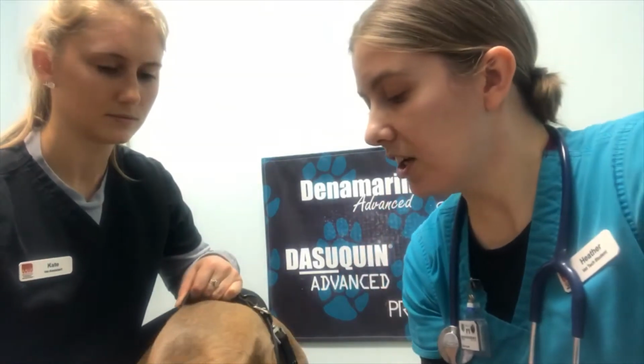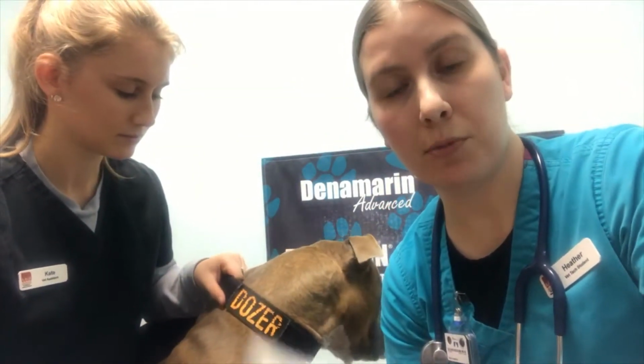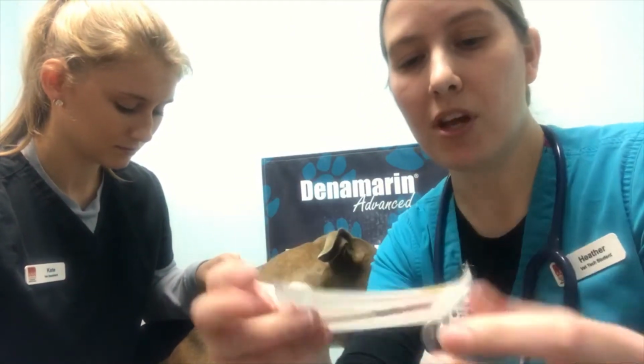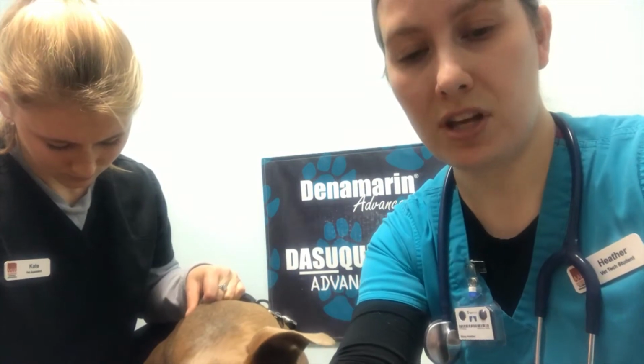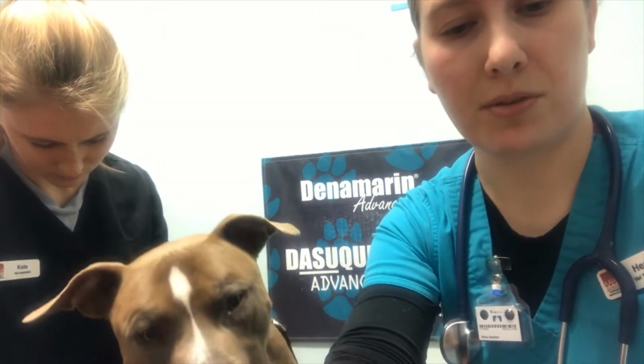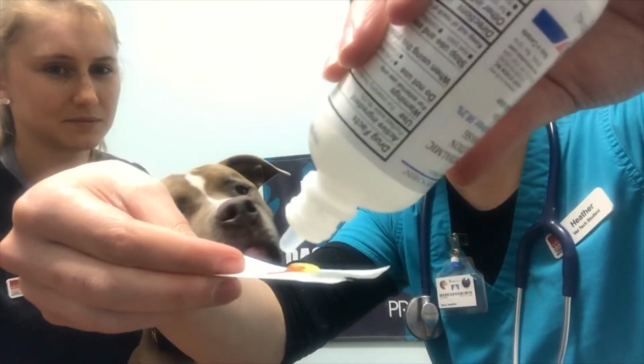So we're going to check for any potential ulcers using a fluorescein stain test here. This result will help determine if there are any ulcers. The first step is I'm going to moisten this strip here with just some ophthalmic solution here.